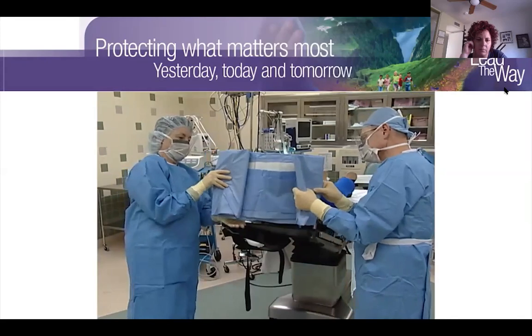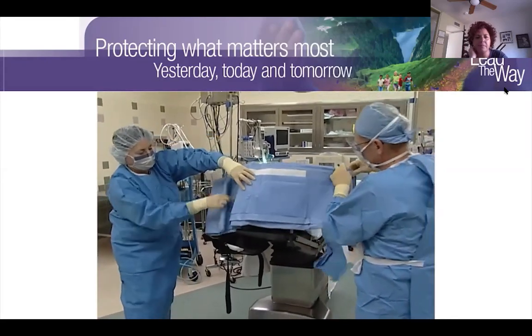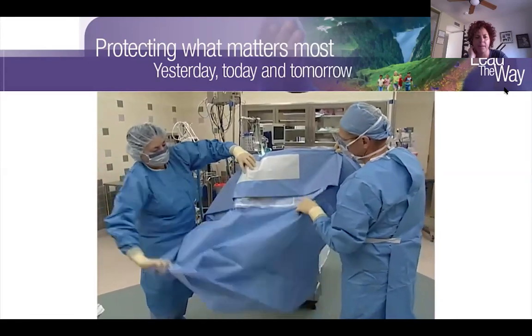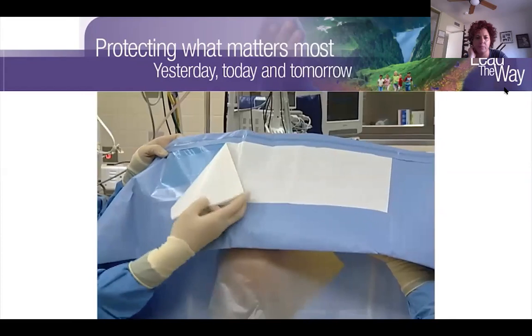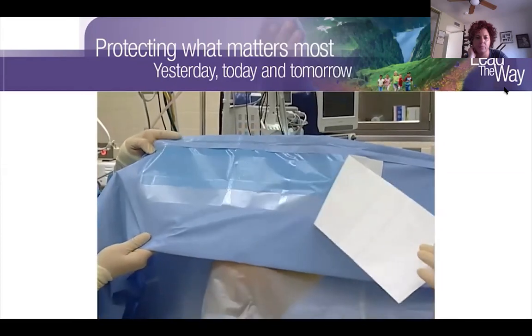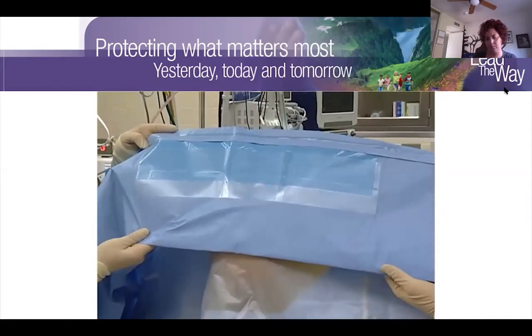Adhere the drape to the head. Unfold the drape to each side. After unfolding to each side, continue by unfolding to the head. Before continuing with the unfolding, remove the adhesive liner and discard. This adhesive will reinforce the placement of the drape during the procedure.